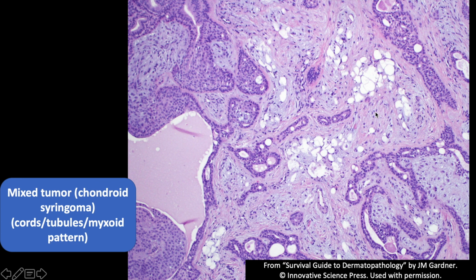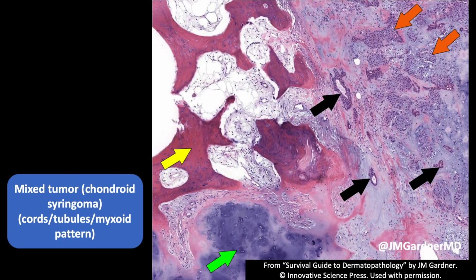background. And this is one of those entities, when I see this on the face, if I'm anywhere near the parotid or another salivary gland, I'm going to recommend either physical exam or, if needed, imaging, just to make sure that this really is a lesion confined to the skin rather than an underlying salivary gland tumor that's pushed up into the skin. So sometimes I'm not given enough clinical information to make that distinction on my own, and in those cases I'm going to alert the treating physician to just, hey, make sure that this is really a skin lesion, not a salivary tumor.